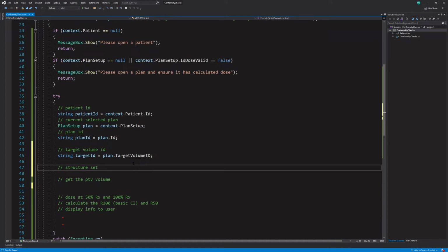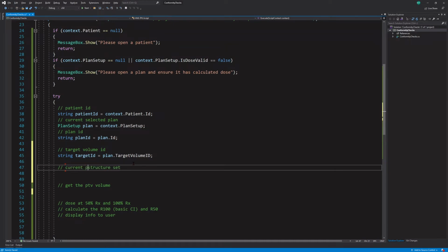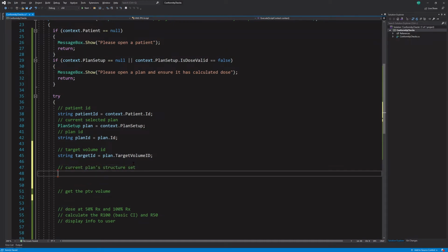But we could also shorten this tremendously. But if you're new to programming, I kind of want to start with some of the basics. So structure set. So we'll say the current plan's structure set equals, and you know what you could also do is just say var, right? But like I said, I'm trying to be as explicit as possible.